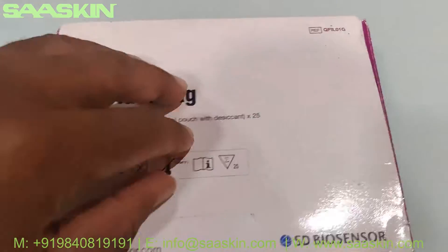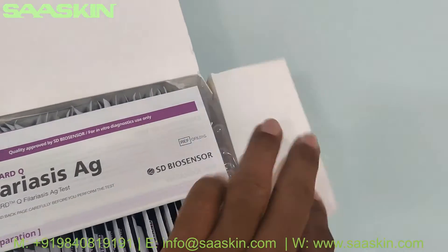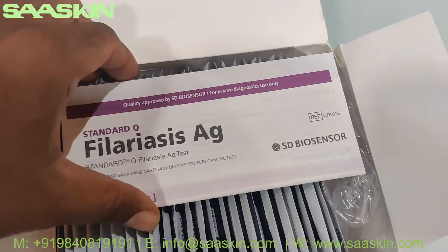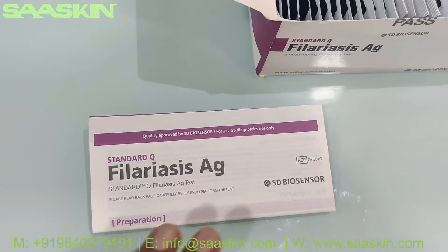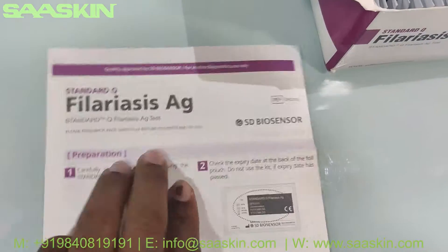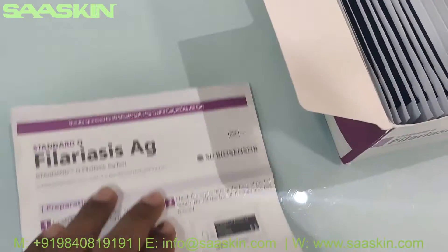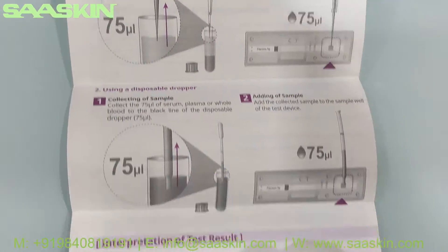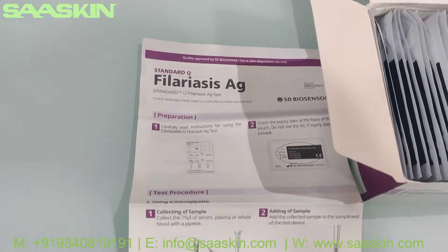Let me unbox this. Inside the box you get an IFU brochure with complete instructions. This manual will give you guidance about how to prepare the sample, how to do the test procedure, and also how to interpret your results — you get all the complete details in this brochure.